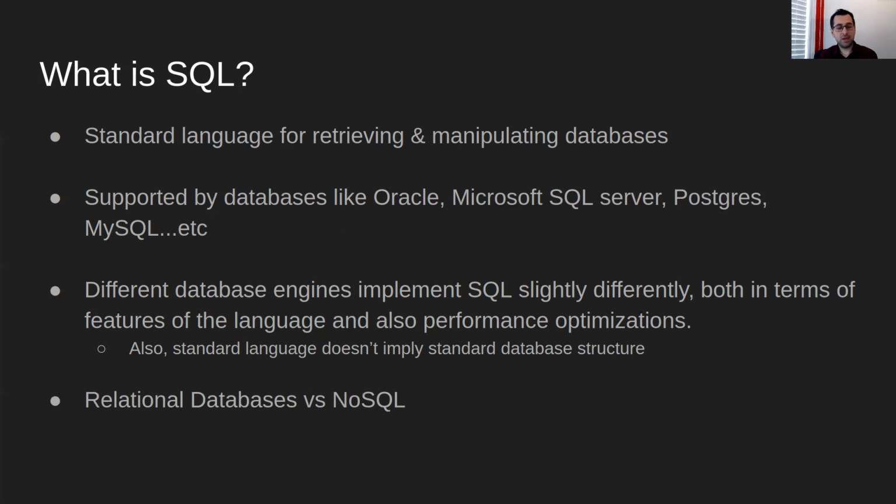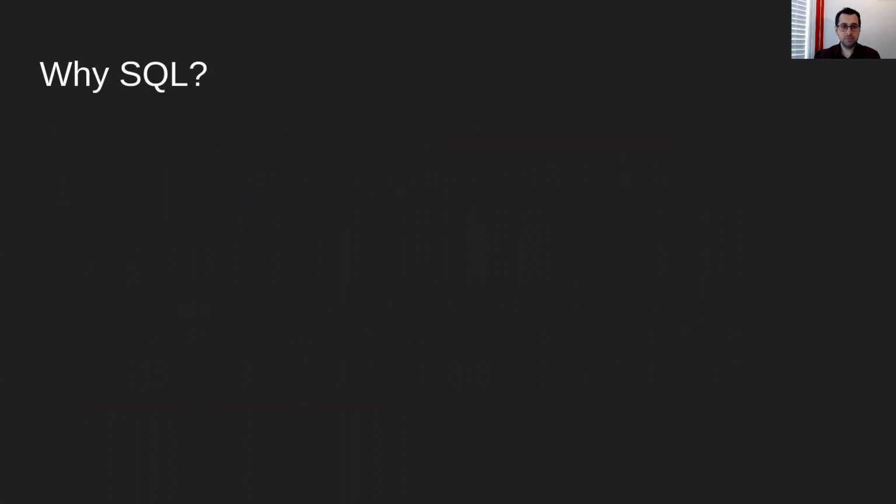Of course, you can't talk about SQL without talking about the elephant in the room, which is NoSQL. NoSQL is a totally different beast than SQL engines. However, some of those NoSQL engines do support the SQL language for being able to retrieve data. But the difference is too technical for us to cover today, so I'm just going to leave it. It's just important to know there's a difference between these relational databases, like the examples I gave above, and NoSQL. They're very different.